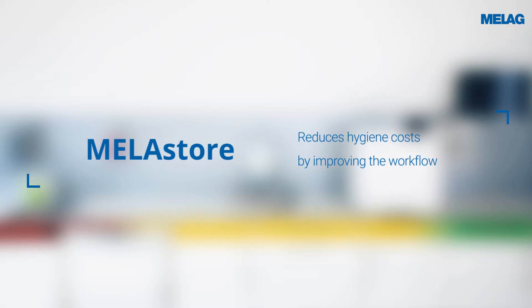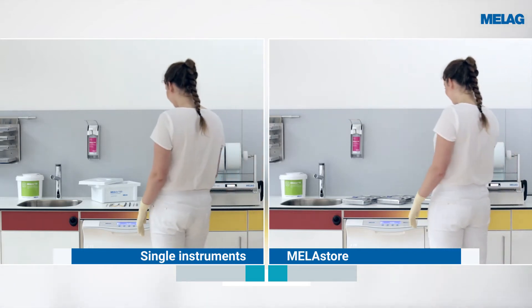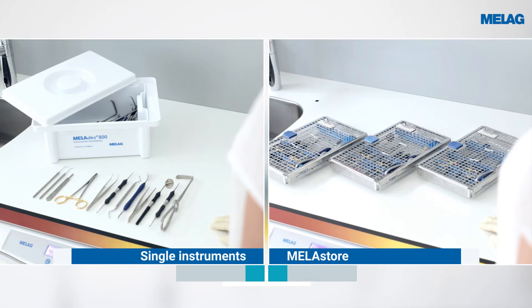Standard conform and safe instrument packaging is an important part of the instrument decontamination process. This comparison shows how much time and thus money can be saved by the use of the MELAstore system.